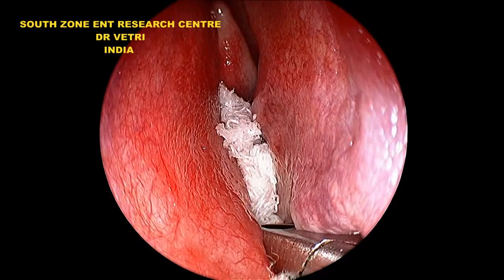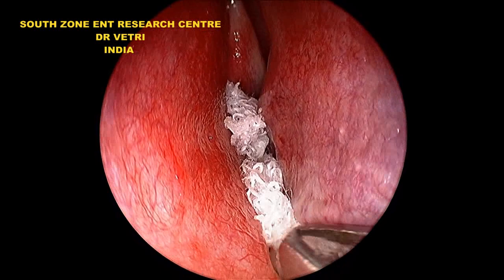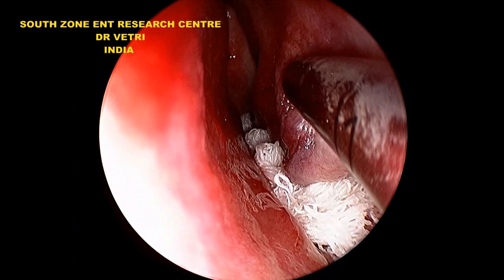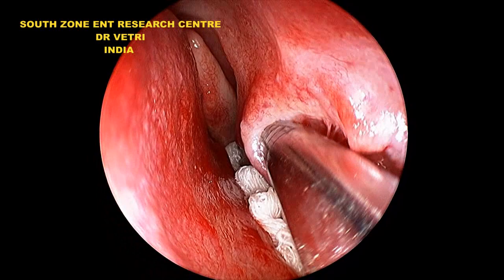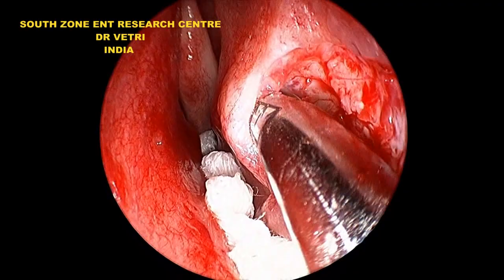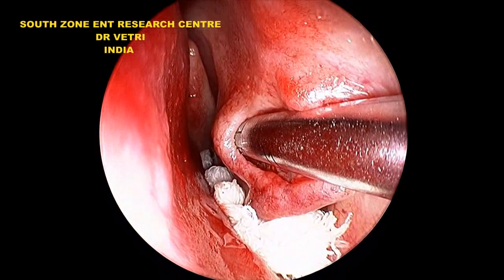The nasal cavity in its posterior part is packed with 4% xylocaine with adrenaline pack to prevent blood trickling into the throat. The anterior part of the left inferior turbinate is punctured through a straight blade of a microdebriter, and the soft tissues are shaved away. The microdebriter works in a submucosal plane.